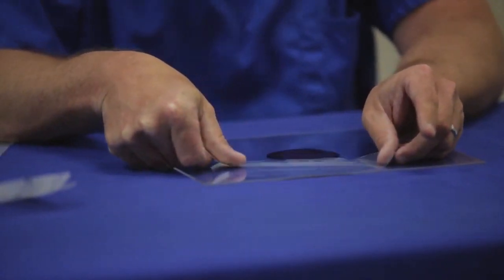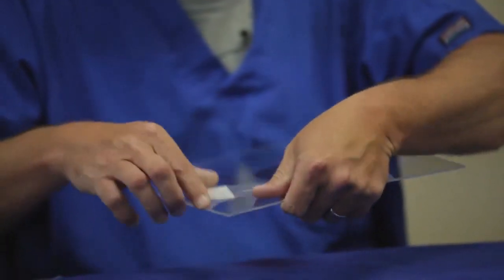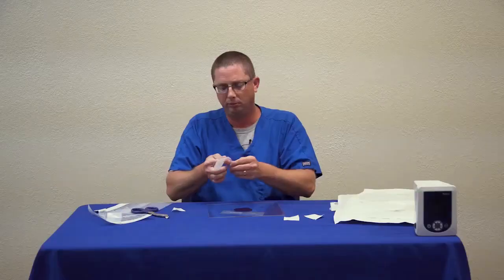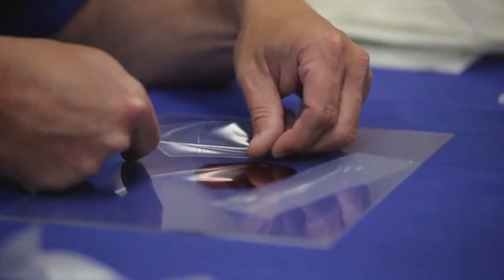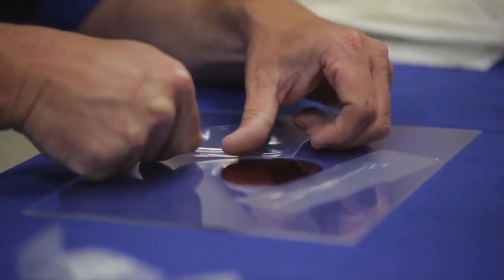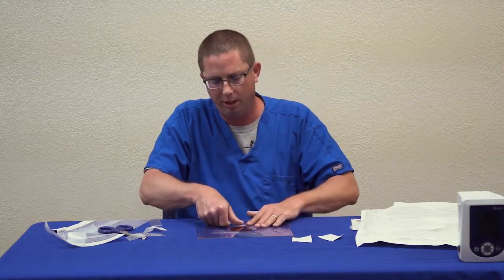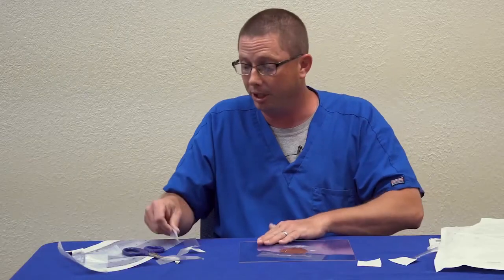So you take the drape, walk it around there, flatten it out, then remove number 3, then pull the tab. I'm going to continue this process until the entire peri-wound is protected by drape. Again, remove number 1 tab, remove the second tab, and continue walking this around the peri-wound area. Again, this just offers protection for the peri-wound area, so in case foam does come in contact with good skin, it does not cause damage to the good skin.